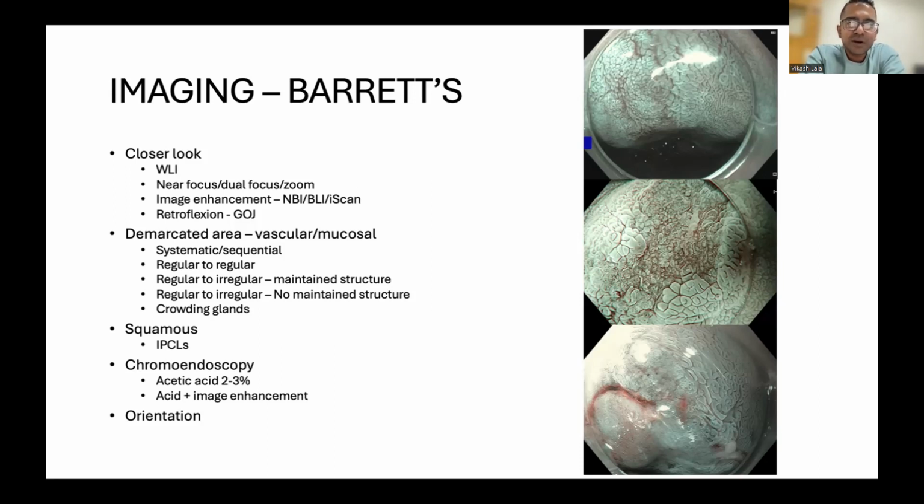So again, it's not about having the highest end equipment, but it's about knowing and being able to use what you do have. And then image enhancement, no matter what system you're using, I think all of the systems now have some form of image enhancement, whether it's Olympus with NBI, whether it's Fuji with BLI, whether it's Pentax with iScan. But image enhancement really does help to look at these lesions closer.